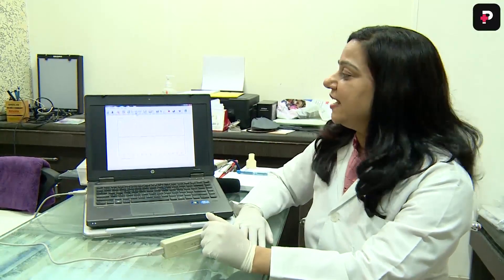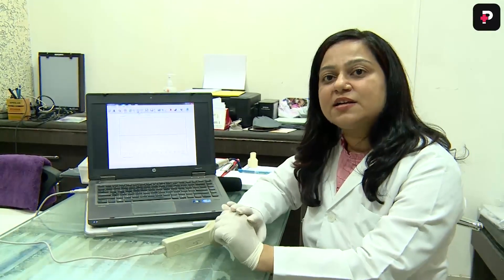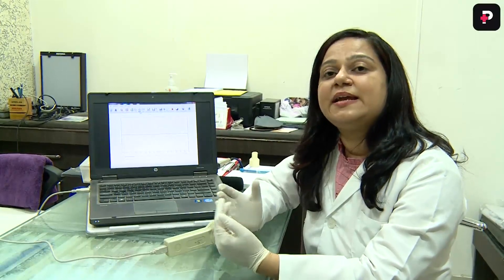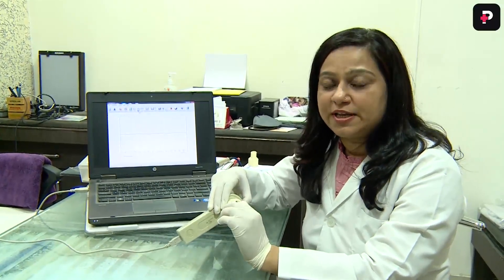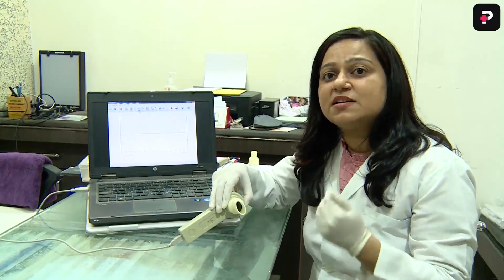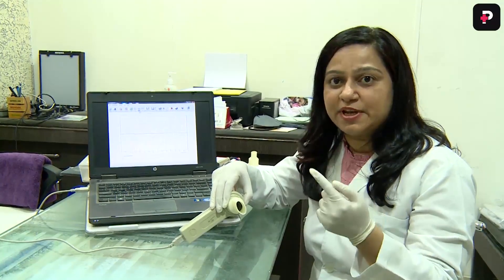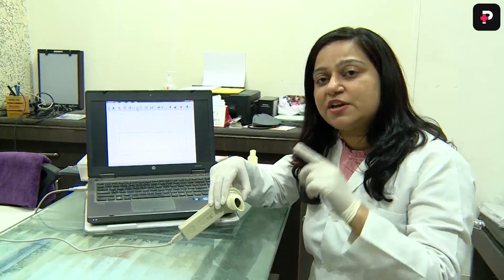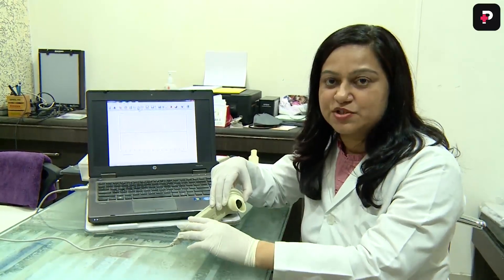The second procedure is the slow vital capacity test. In that, you have to ask the patient to inspire and expire normally into the mouthpiece for two to three breaths — that is tidal respiration — followed by one deep inspiration and expiration. Again, it is followed by two to three tidal respirations.